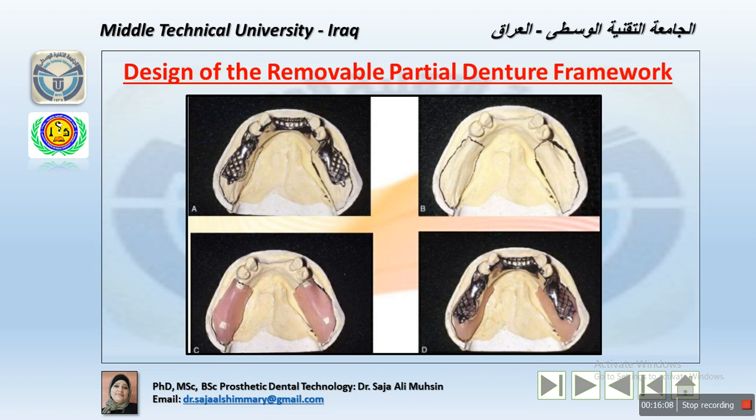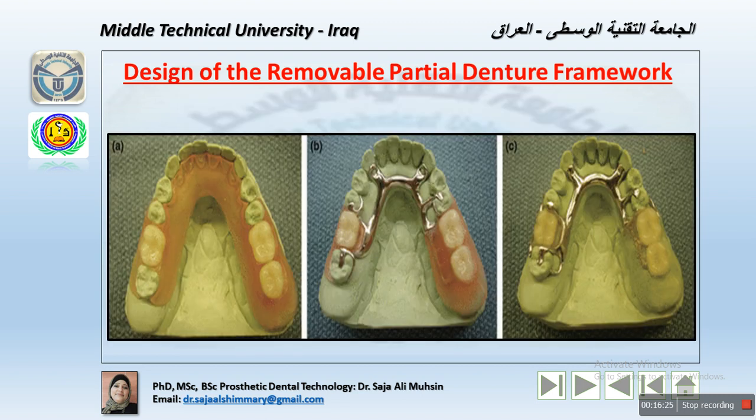Okay, the retromolar pad region of the mandibular residual ridge and the tuberosity region, of course, in the maxillary residual ridge, therefore are subjected to the greatest movement of the denture base. So it is possible, however, that the proximal plate minor connector adjacent to the edentulous area will not disengage from or break contact with the guiding plane.